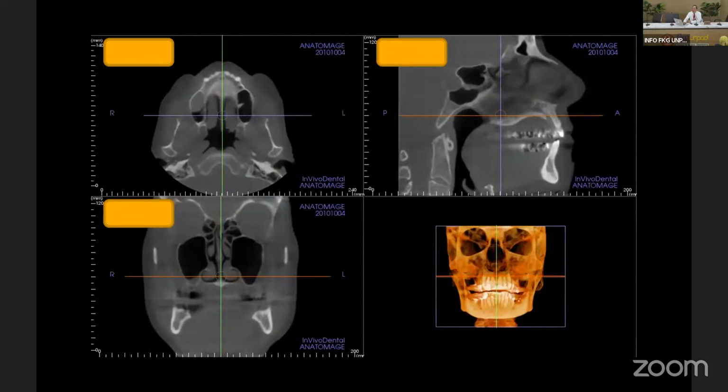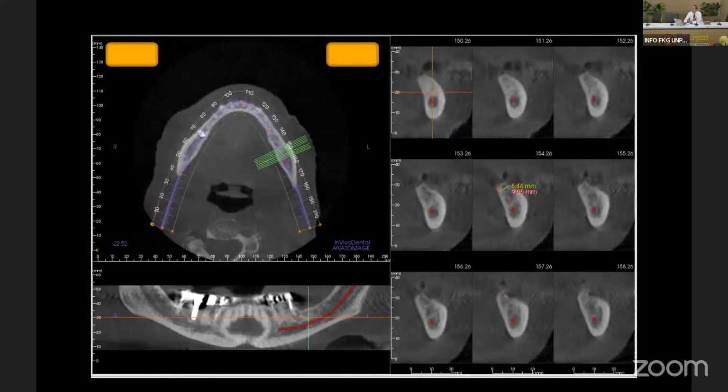Now with the 3D data, we can generate different sections, different planes. We can have the axial view, coronal view, and sagittal view, and also generate a surface reconstruction. Most importantly for us, if we do dental implants, the cross-sectional view is the most helpful. You can select the tooth location, then do the cross-section, and you can get the bone height, bone width, and the inclination of the bone.